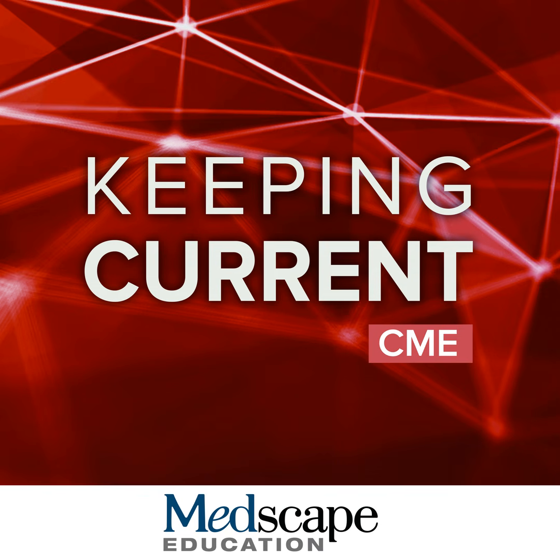We do need to make sure to prioritize the quantitative analysis. And if you are ordering these studies, it may help to actually state in the order that you need the quantification. Or if you are in radiology or nuclear medicine and you're giving these results, it's very important to include that Centiloid. You can avoid repeat work if you include it up front, but please make sure to do your quality control and give comments, especially if you think that that Centiloid value is not correct or is discordant from the visual read. It's really, really important to include a description of why that is because this directly impacts how that caregiver and family are going to use that result.